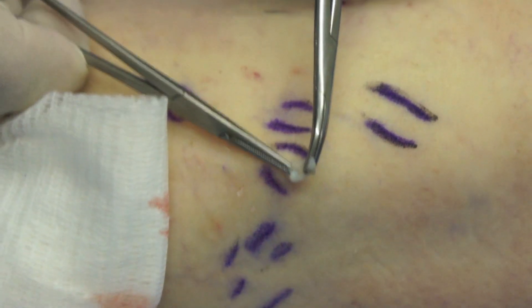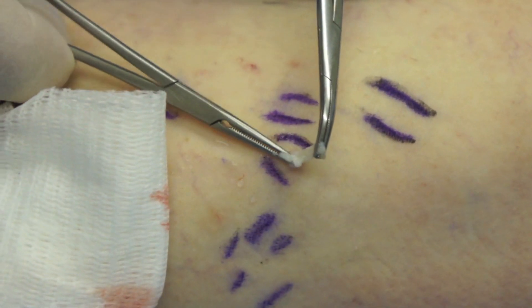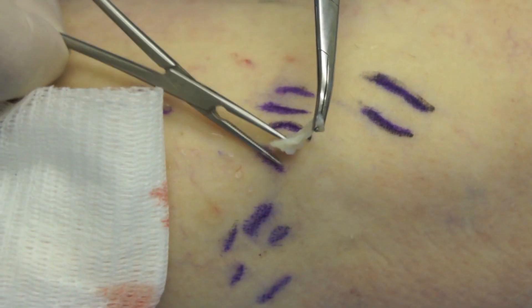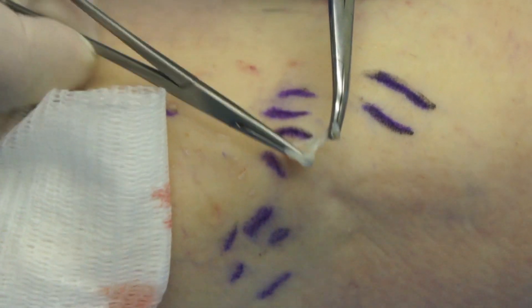As you can see, I have marked the skin either side of the vein, and I used the dermal punch between the marker lines to prevent the possible risk of skin tattooing.